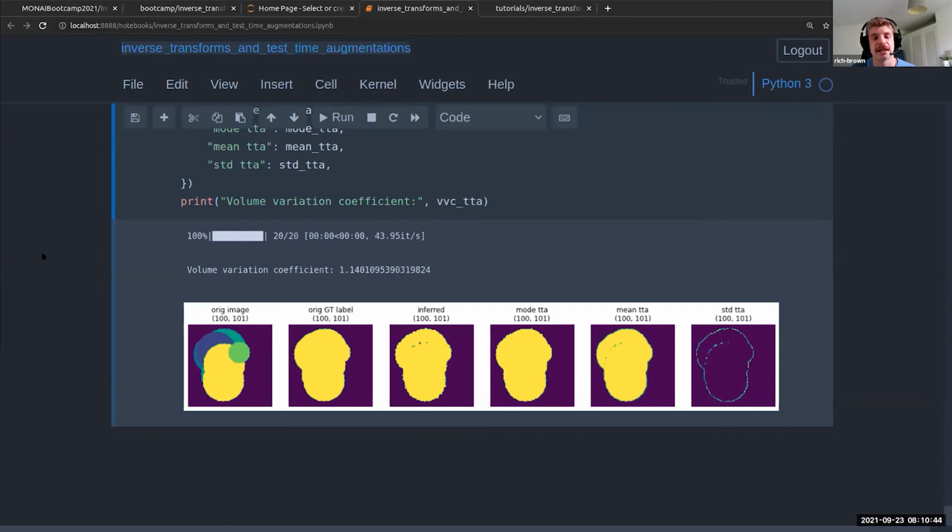So for example, spacing D does modify the metadata, and so when you use the inverse of spacing D, which is also spacing D, it will then modify the metadata, and so it should return to how it was.